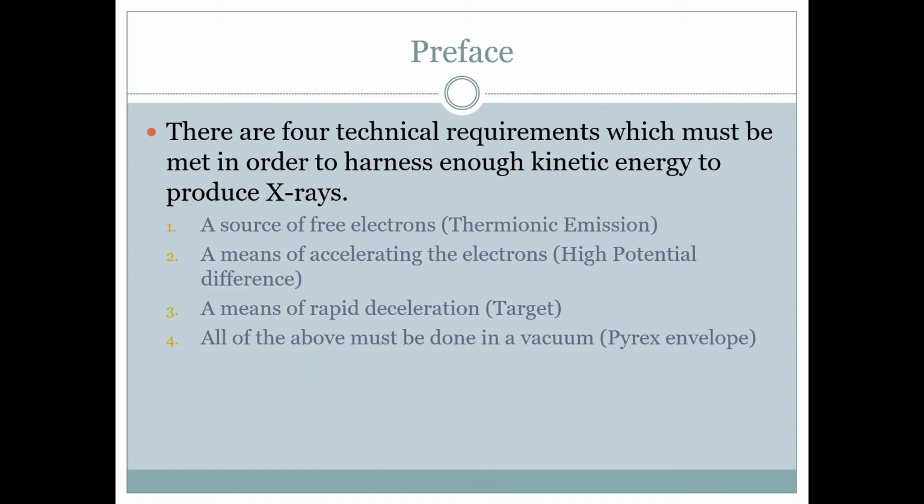That is our tungsten target, our anode, our anode disc. Specifically, the anode discs in our X-ray tubes rotate. We could still create X-rays without a rotating anode, but that rotating anode has the nice quality where it gives us a larger surface area to heat up, so that we can make X-rays more efficiently.